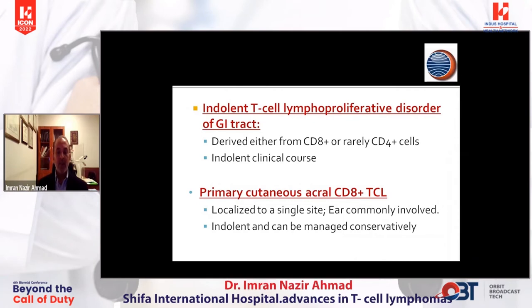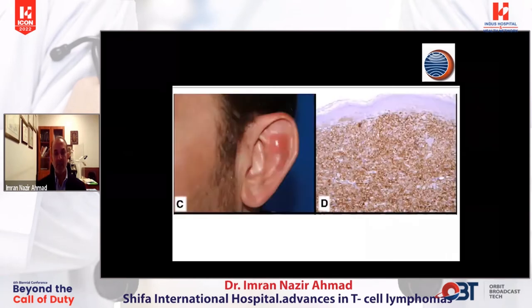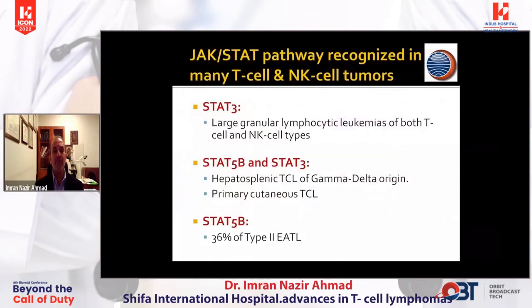Then primary cutaneous acral CD8 positive T cell lymphoma is a localized disease limited to a single site, ear being the most common, and it also has a very indolent course, doesn't need chemotherapy, and is usually managed conservatively. So this is the picture: in the skin, it has a shiny nodule involving the dermis, and it has CD3 positivity.